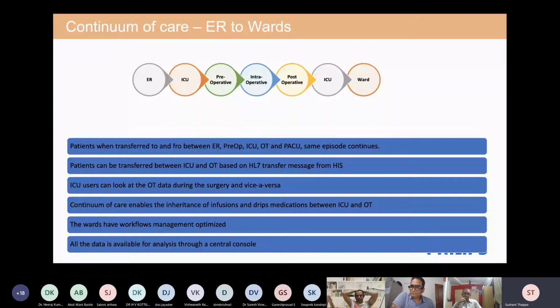For example, one thing Chris also pointed out was that infusion pumps now are coming in with a lot of connectivity options. And you don't need a central station, to be fair, for any of those connectivity options. They can directly send the data to a central server, and that central server is intelligent enough, through Centricity for example, that this data can be stored in context, and then presented in context later on as well. So, right from infusion rates to drugs and interactions, along with patient condition and care area, all of these things get combined at the central server level.